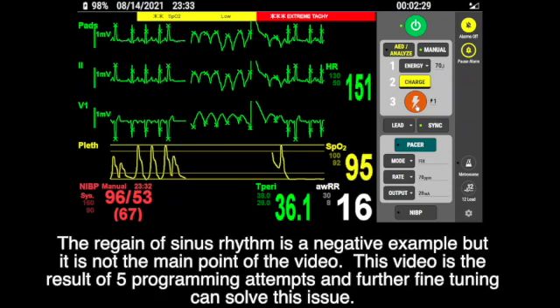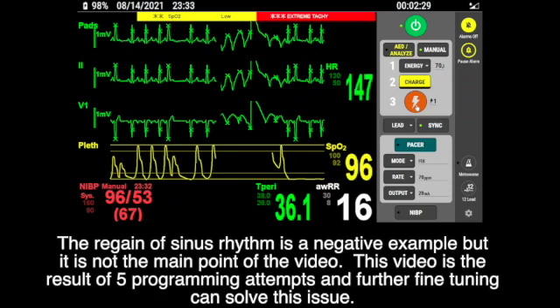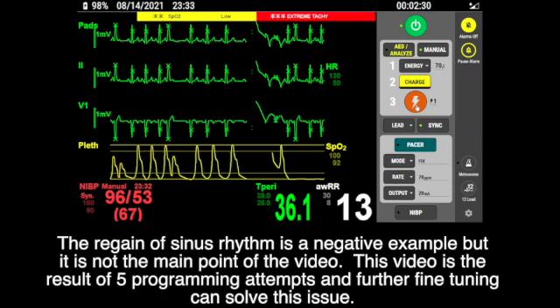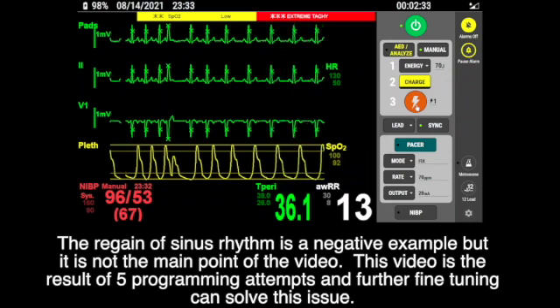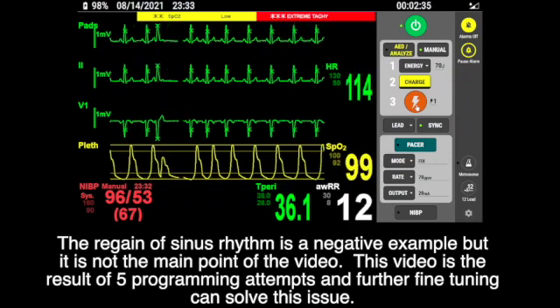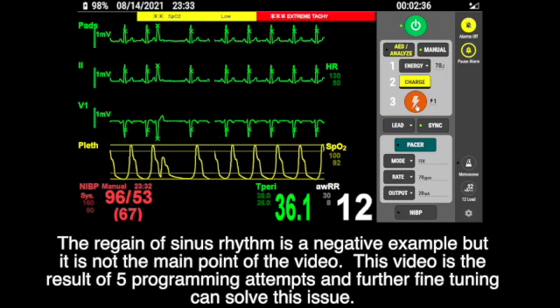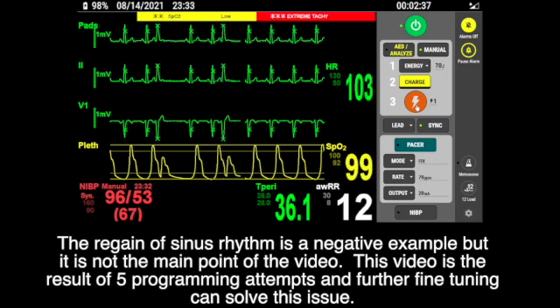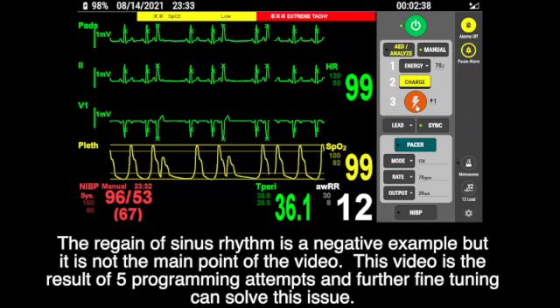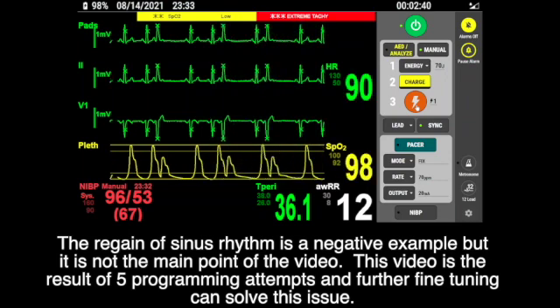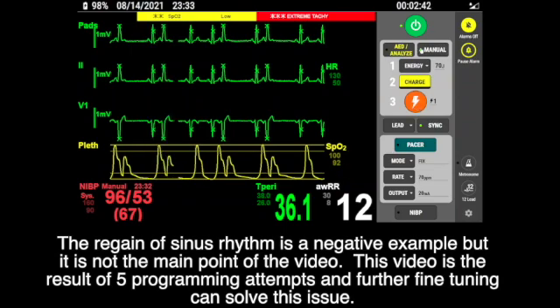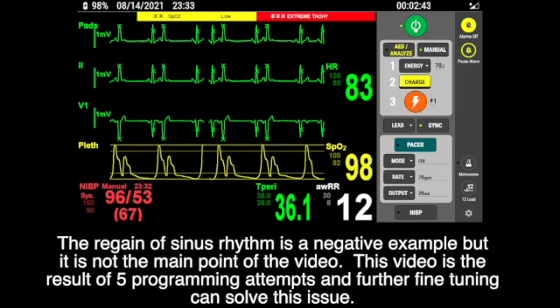The regain of sinus rhythm is a negative example, but this is not the main point of this video. This video is the result of five programming attempts, and further fine tuning can solve this issue easily.